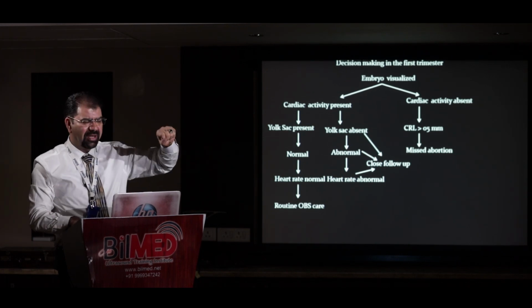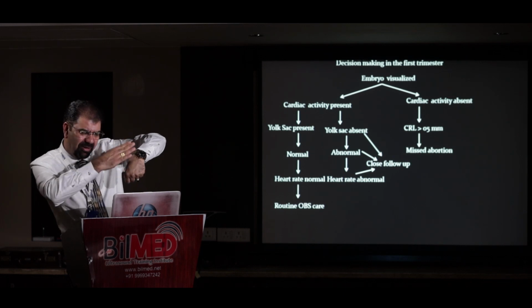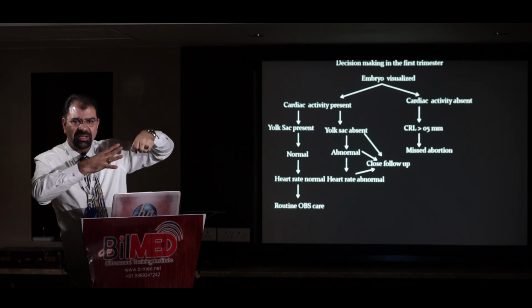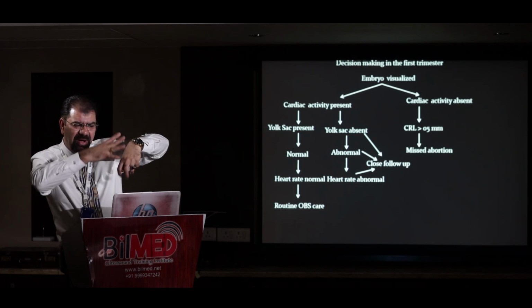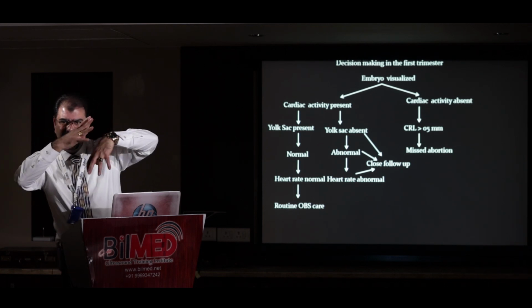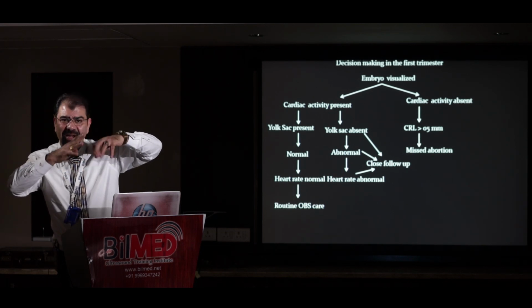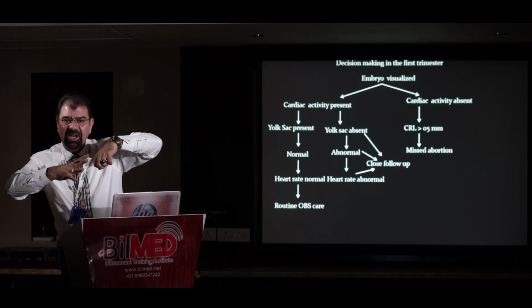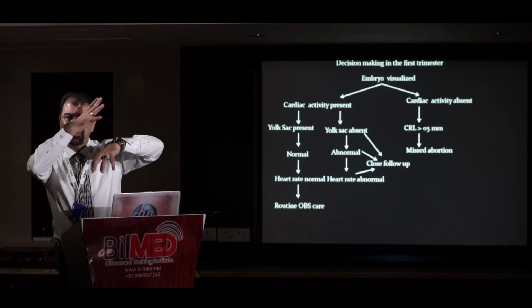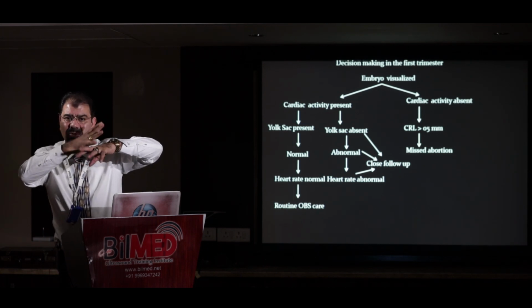If the fetal heart is here and my scan plane is away from the heart. Now see, this is heart. I am cutting here, not here. Now see, if I put the color, I should put color on a beating thing, then I will see it. I am putting color, I will not see anything. I should cut the scan plane through the heart, then I have to put color.